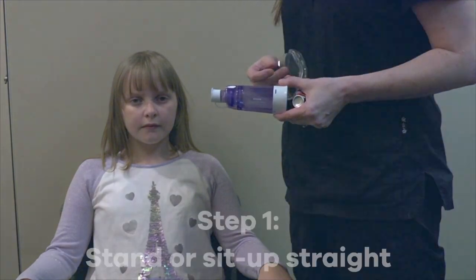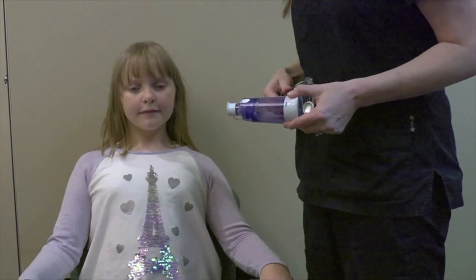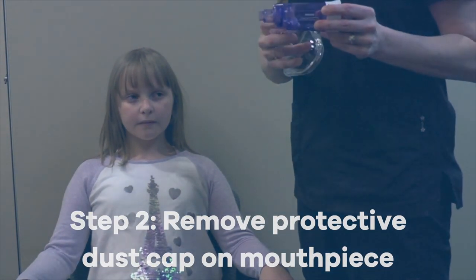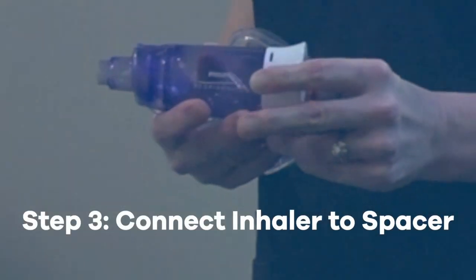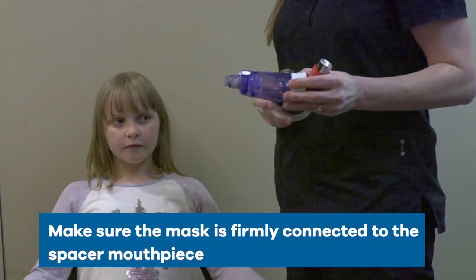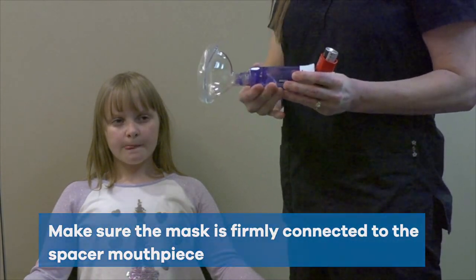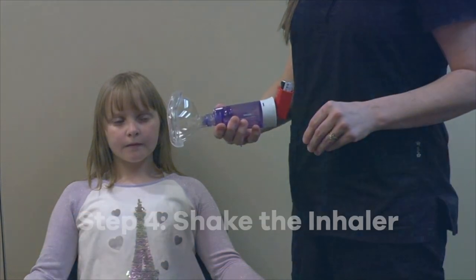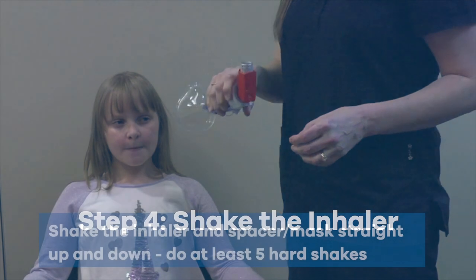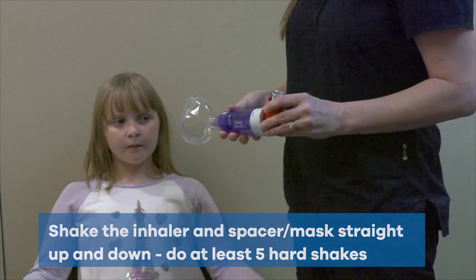Step 1: Stand or sit up straight. Step 2: Remove the protective dust cap that covers the mouthpiece. Step 3: Connect the inhaler to the spacer, and also make sure the mask is firmly connected to the spacer mouthpiece. Step 4: Shake the inhaler hard at least five times, making sure the inhaler stays straight up and down while you shake it.